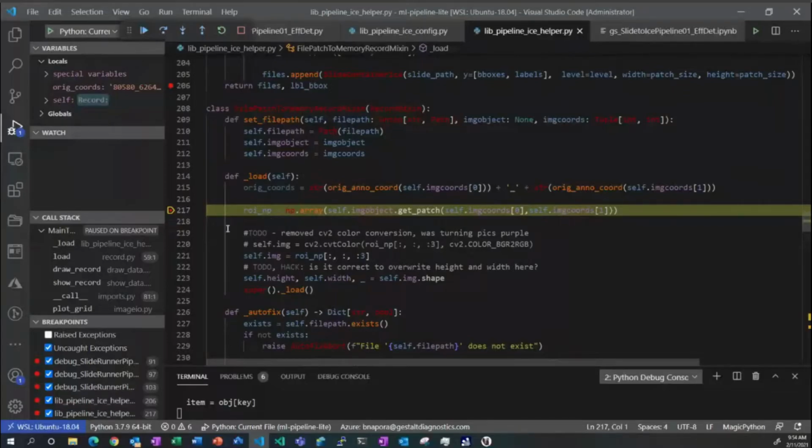Initially, when I was using IceVision, I created a routine to extract and then convert to Coco style, and was importing those. But as I was experimenting with different patch sizes, obviously that becomes onerous. And we're dealing with really large data sets as well.